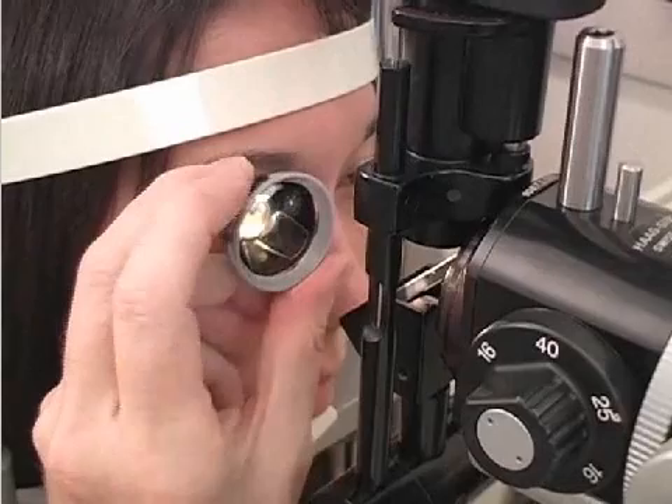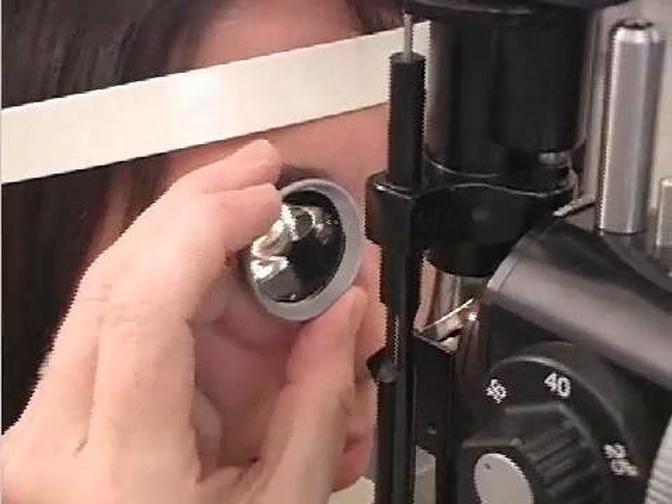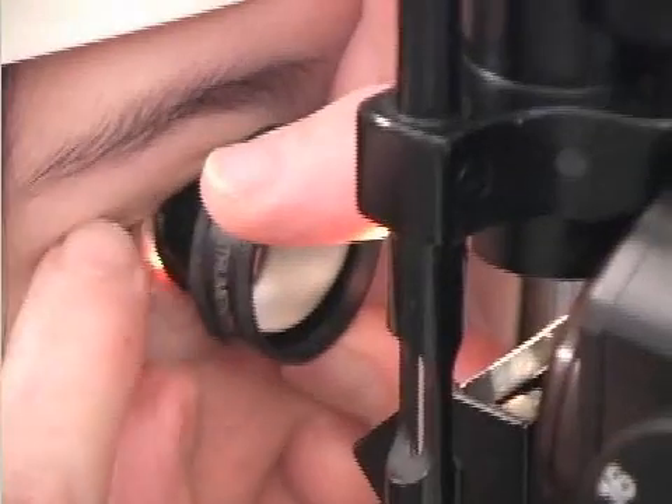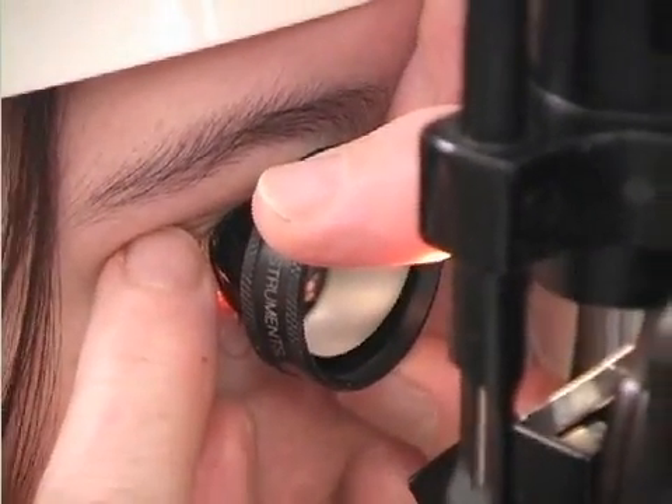At the end of the examination, the lens is often sucked onto the patient's eye, and one can remove it simply by pushing against the patient's eye with the index finger and breaking this seal.